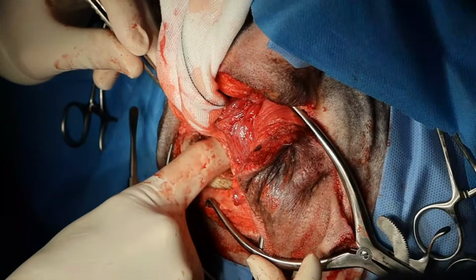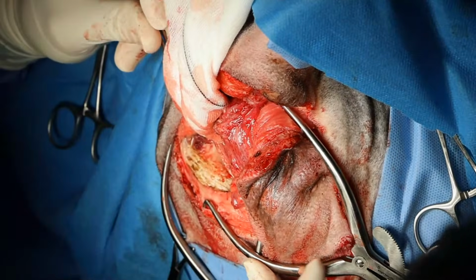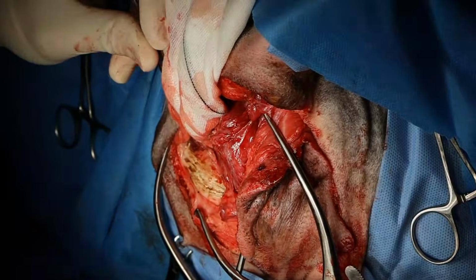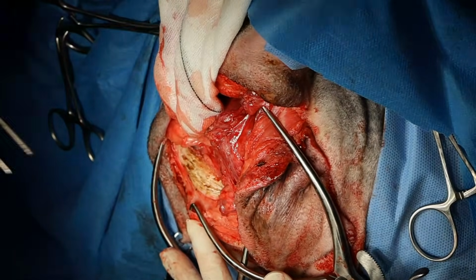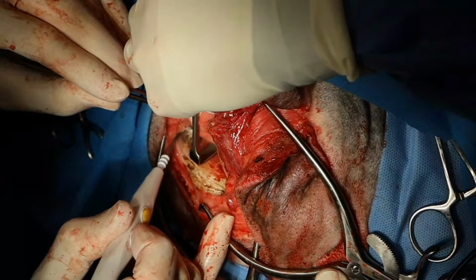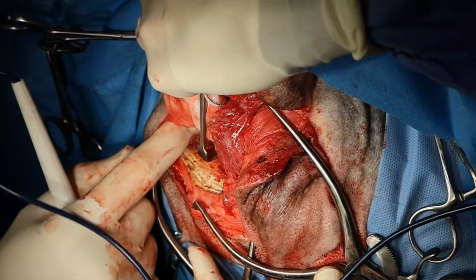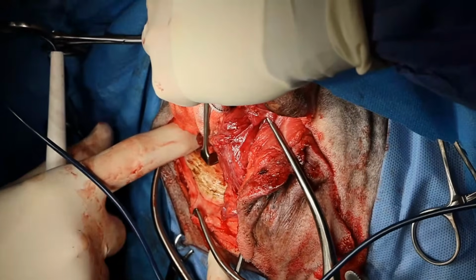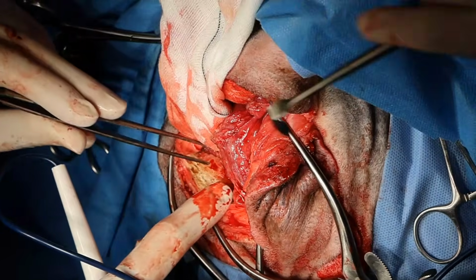All right, so my finger is in the obturator foramen in there. You guys want to feel that? Jam your finger in there. So you elevated the internal obturator all the way up to that, yeah. That's probably the sacrotuberous ligament right there. I can feel that. There's a really firm band right there, right in front of it. Okay, so I've elevated that.